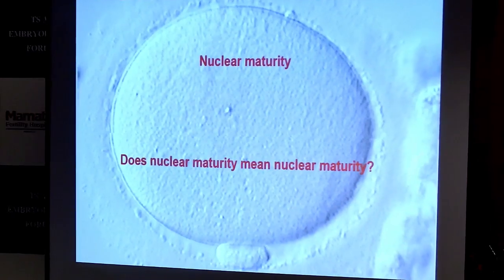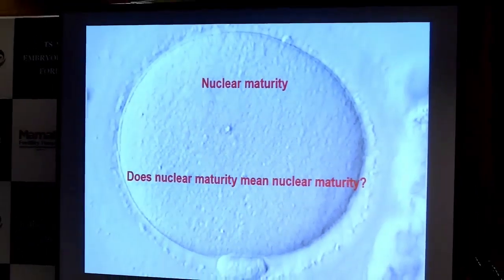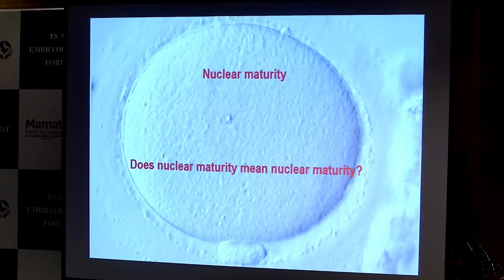So when you look in your laboratory and you see the polar body, you see something like this, are you sure that this is an M2?